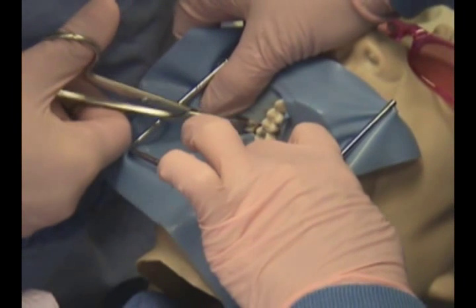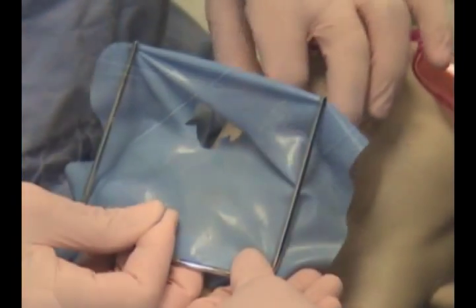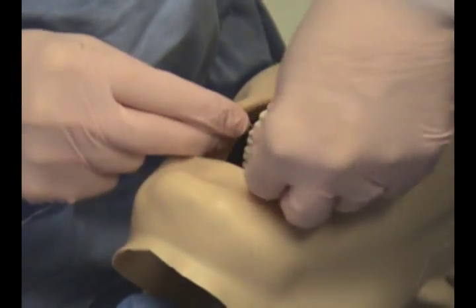Using a pair of rubber dam scissors, the rubber dam is carefully cut between each tooth. The rubber dam and frame are now removed. Each contact will now be flossed to help remove any rubber dam material that is still present.